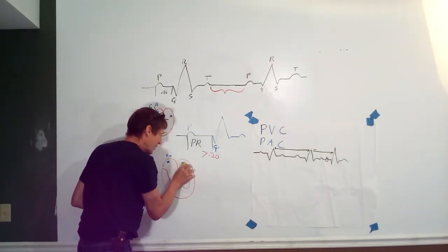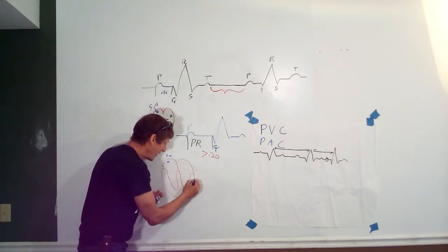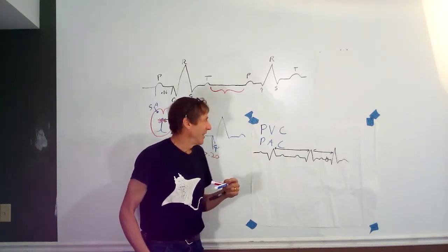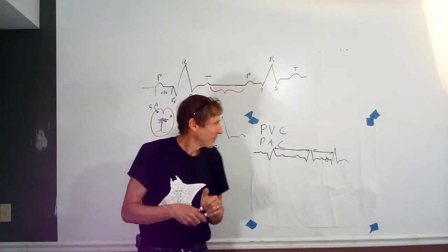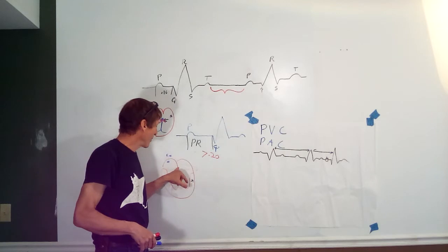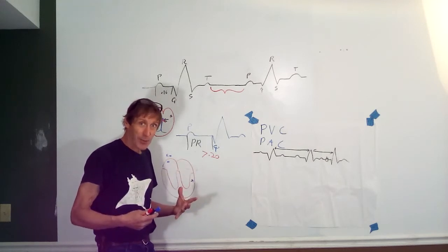The ectopic cell is not in the atrium. It's somewhere in the ventricle. Of all arrhythmias, this one's actually pretty easy to spot, even with minimal training. With this one, the SA node will fire normally, and you'd have a normal EKG, but then, at some point, you get this ectopic cell in the ventricles generating action potential prematurely.